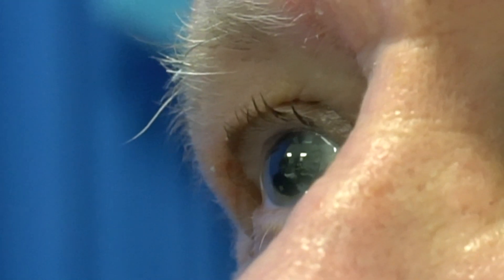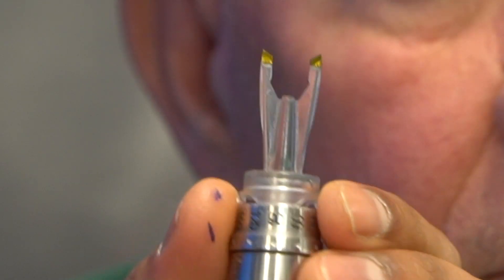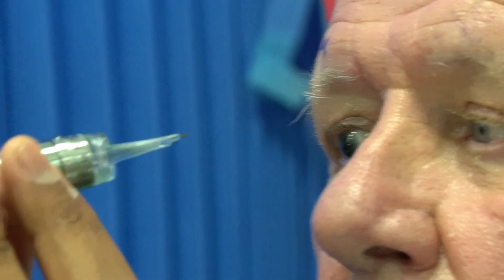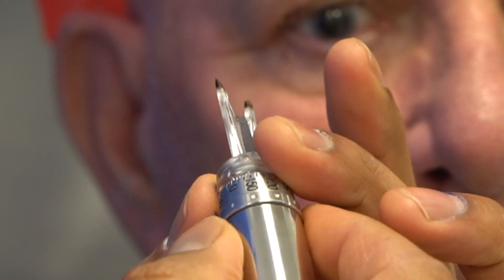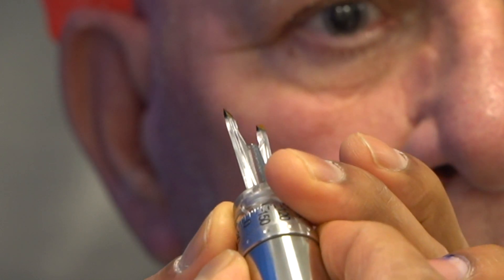The first thing I'm going to do is mark the eye for a toric lens. So this is a Robo marker, and this is a pretty nifty device. No matter how I turn this device, the angle still stays the same. So for this particular eye, I'm just going to mark at 0 and 180.